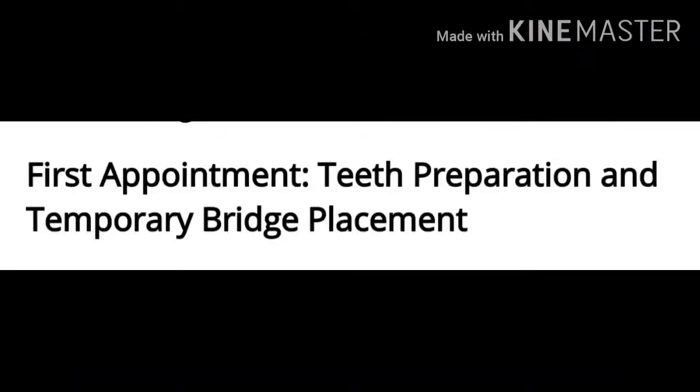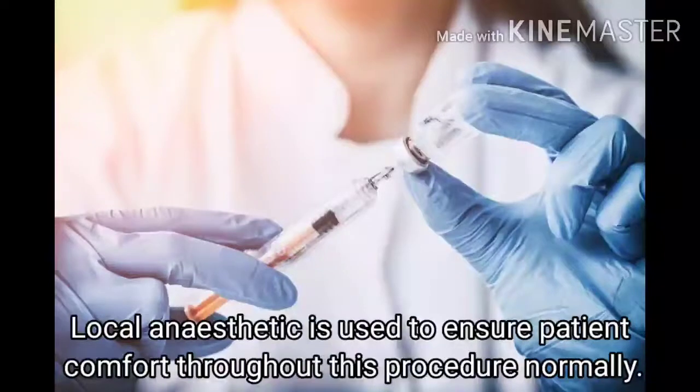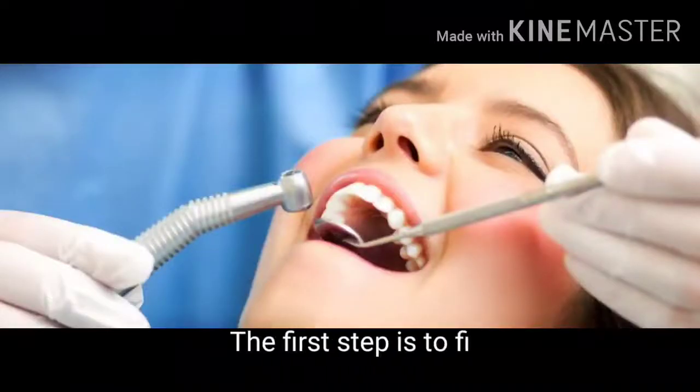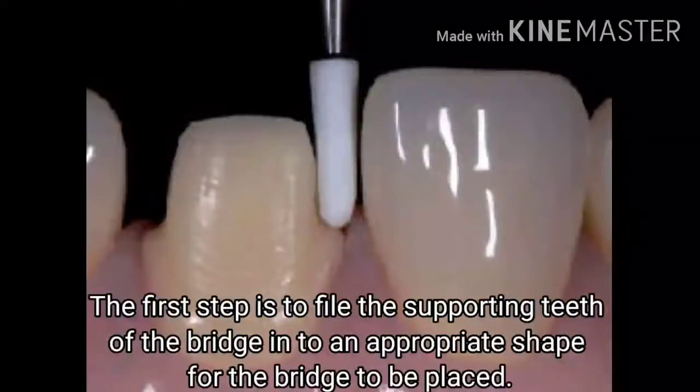The first appointment includes teeth preparation and temporary bridge placement. Local anesthetic is used to ensure patient comfort throughout this procedure. The first step is to file the supporting teeth of the bridge to an appropriate shape for the bridge to be placed.